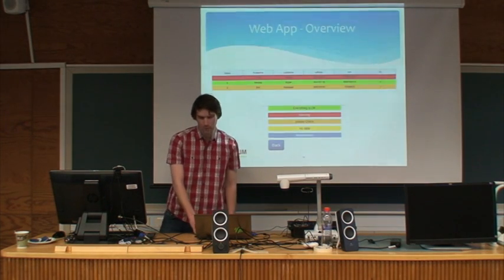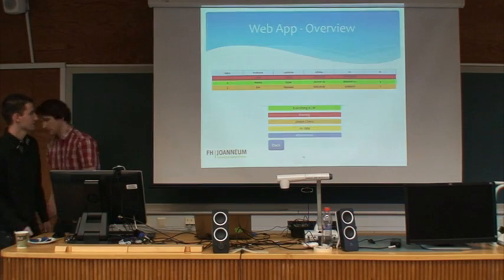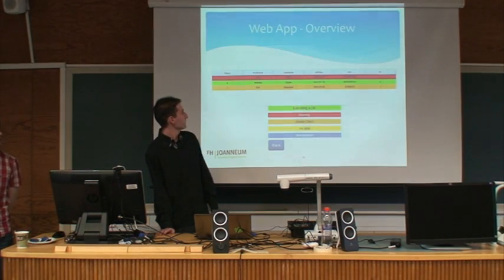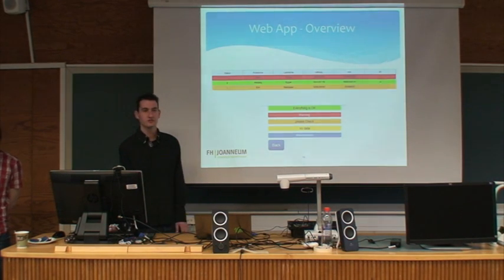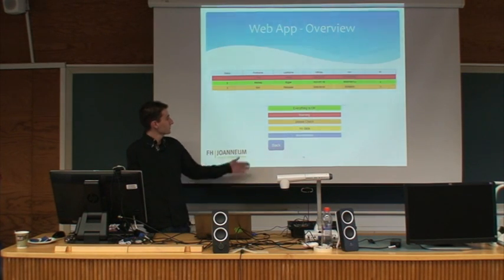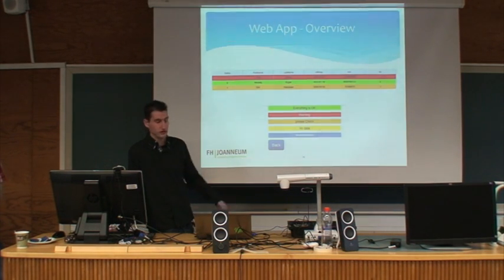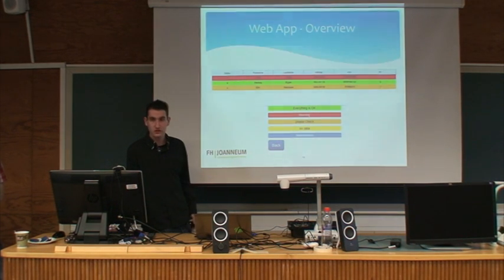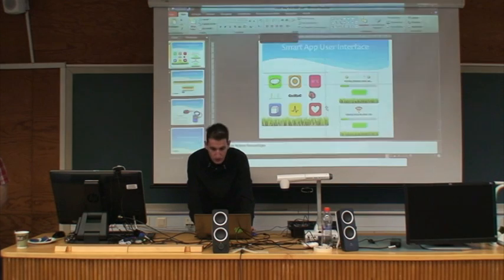So we extended the web app. We chose to give the physician an overview of all the information. We created a couple of statuses, for instance, okay, warning, and that maintenance is needed, so the physician knows if the product is still okay and probably functions. I can show you online.